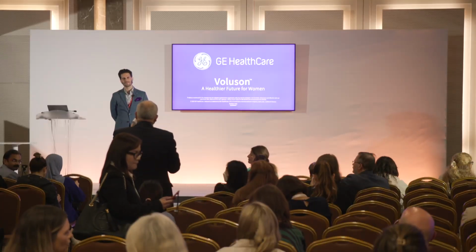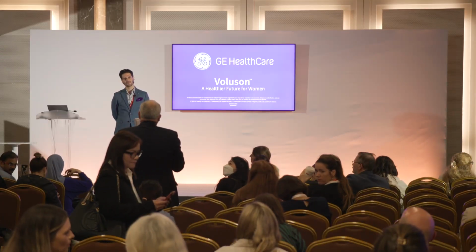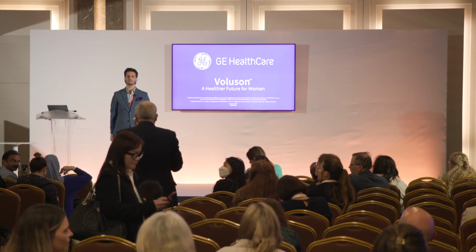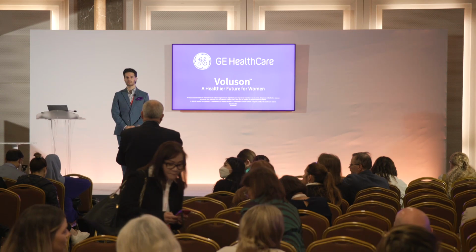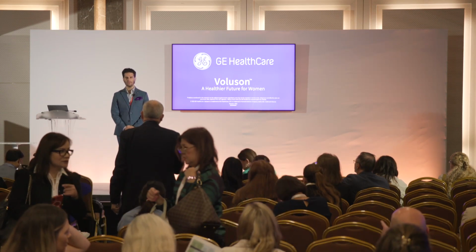Thank you, Matthew, for a beautiful lecture. I have two practical questions. When you find such small, subtle findings, do you need to do the laparoscopic confirmation of them? No. You never do? I wouldn't say I never do.